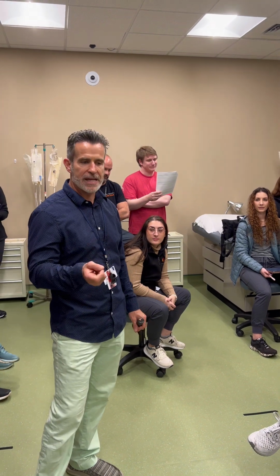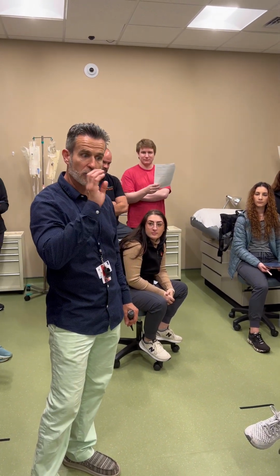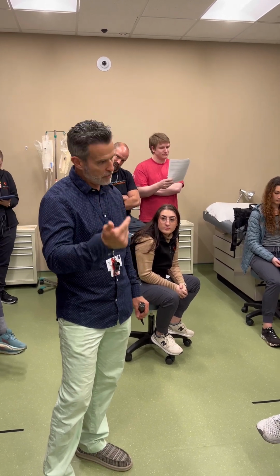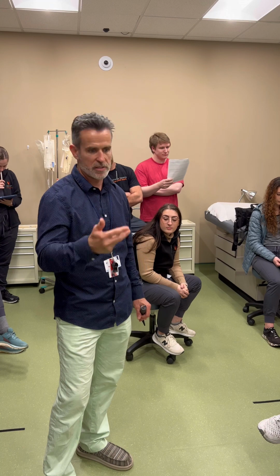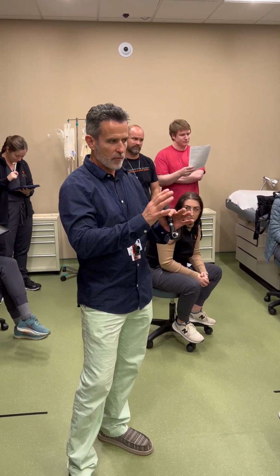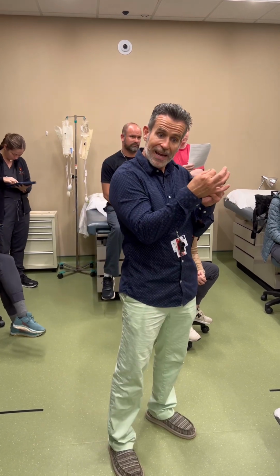So with that being said, looking at the external auditory canal as you go in, just don't get focused on the tympanic membrane, looking for the umbo, the malleus, the pars flaccida, pars tensa, the cone of light, the translucent, pearly gray, all that stuff. Really focus on the external auditory canal and then look. And if it doesn't come into focus, you may have to pull the ear a little bit.